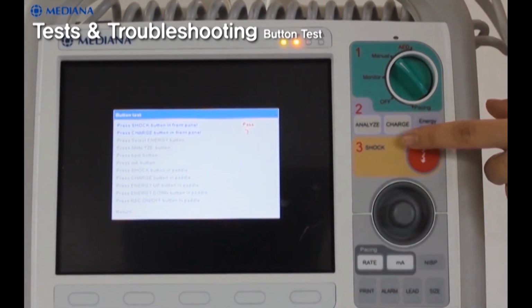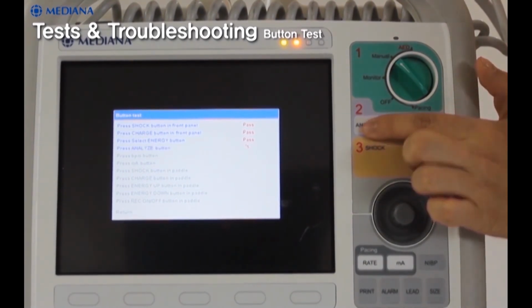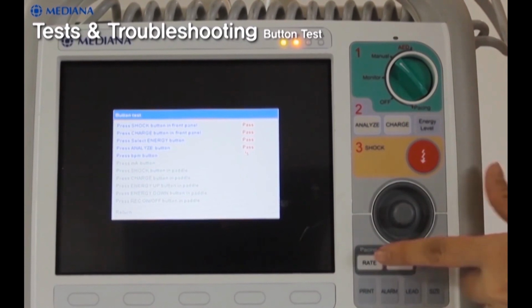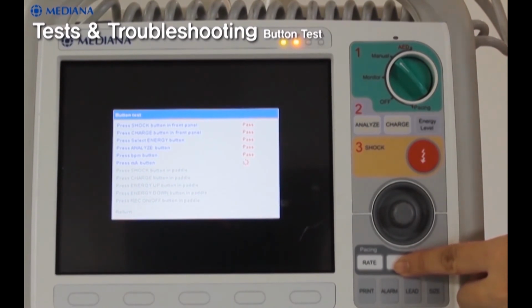Shock, charge, analyze, energy select, BPM, and milliampere buttons can be checked on the front panel. And shock, charge, energy up, energy down, and recording buttons can be checked on the paddles.